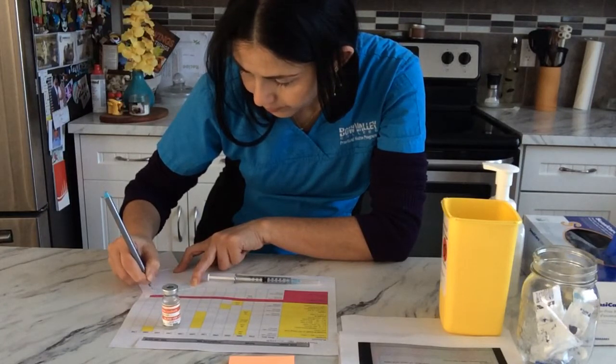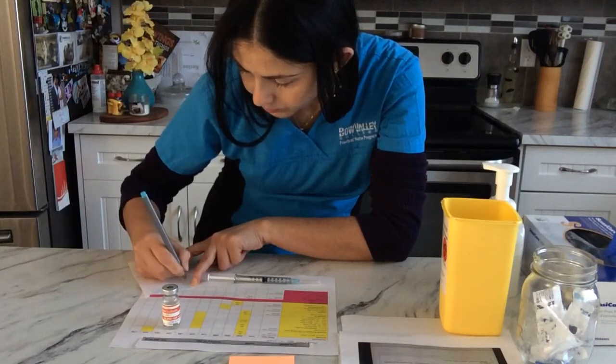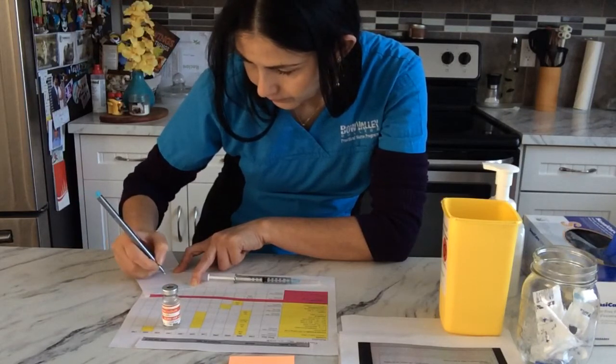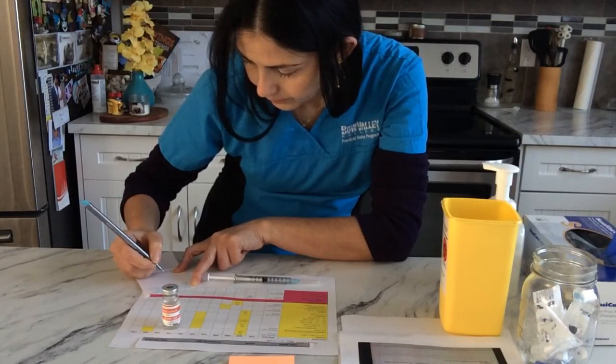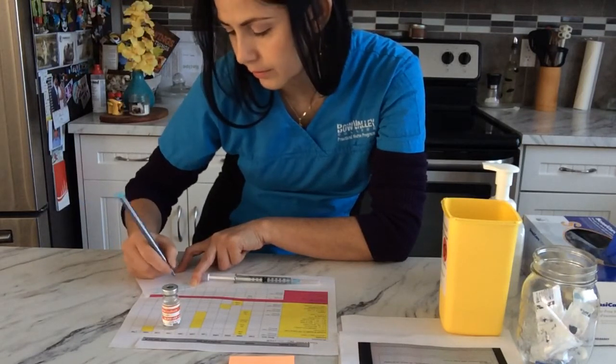And we draw 0.5 ml. This is a subcutaneous route. And I'm going to put my initials.